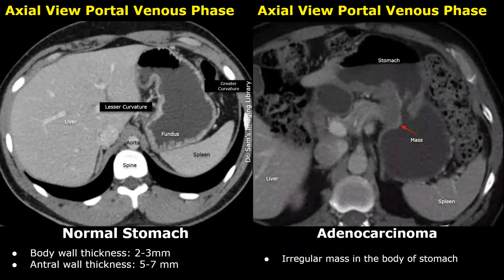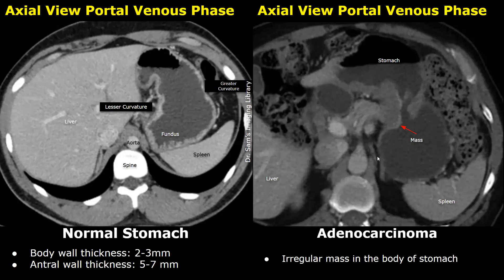This image also shows an irregular mass in the body of the stomach at the lesser curvature. The mass is enhancing during the portal venous phase. Its abnormally increased size suggests deeper invasion into the muscular layers of the stomach. However, the perigastric fatty tissue appears normal with its normal hypodense gray color, so the mass may not have invaded beyond the serosal layer.